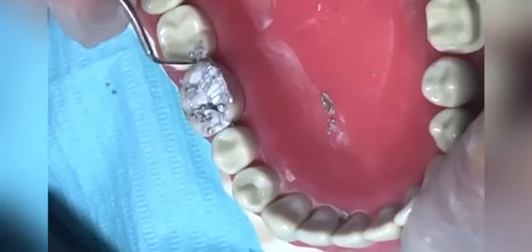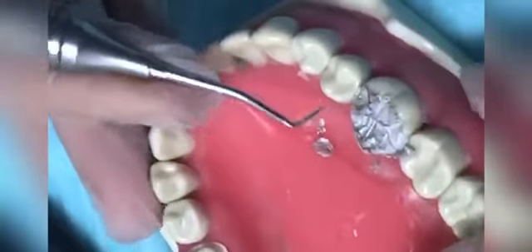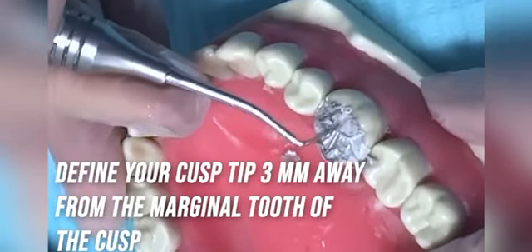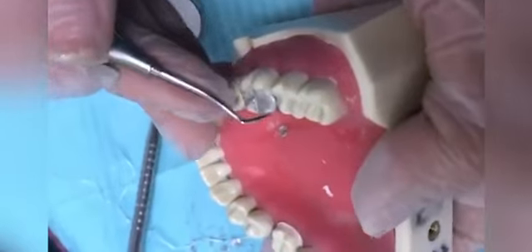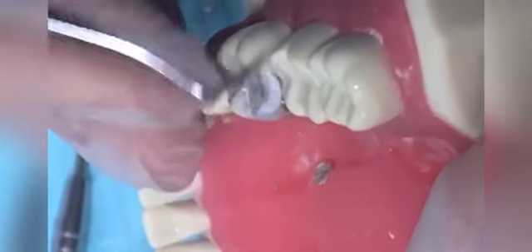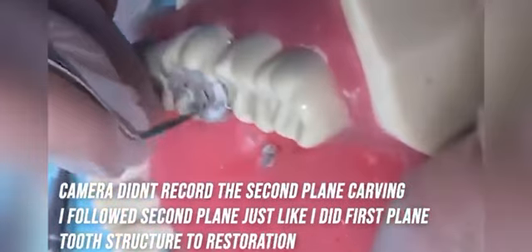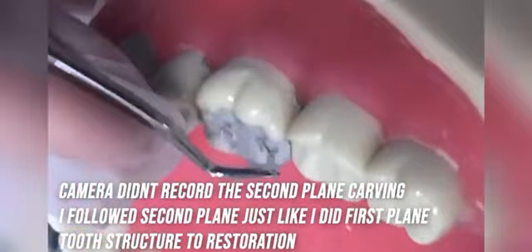Here I'm doing the basic anatomy, keeping my instrument at an angle of 30 degrees, half on the tooth surface and half on the restoration, so it will not create any ditch. Okay, so I'm lowering the marginal ridge height a little bit, because if it's high the restoration can break and it can come under the straight fail criteria.